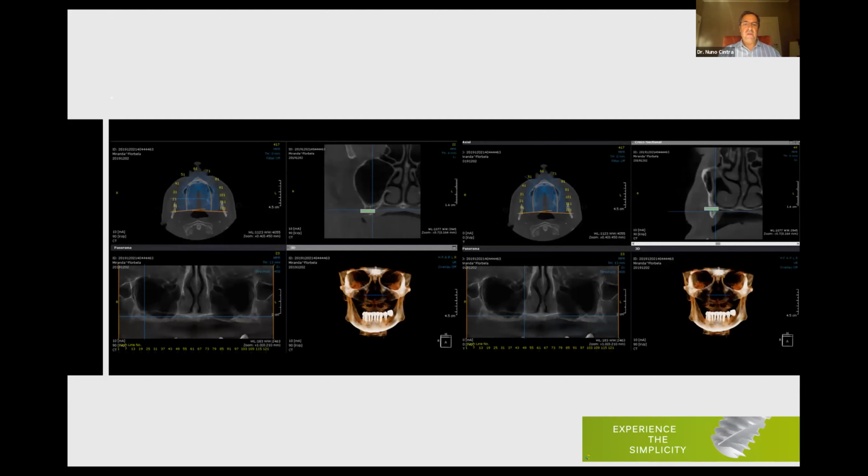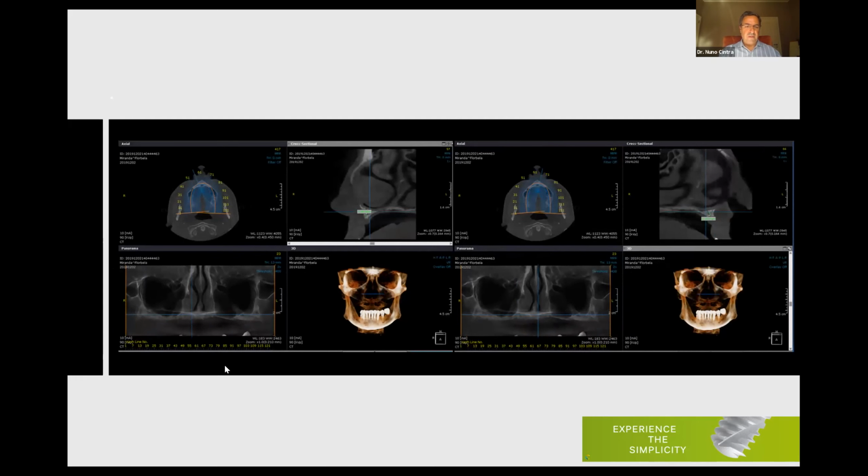because we have to think that sometimes we have some discrepancies in the CT scan readings. So situations like this one, look at this case. If you see the measures on my left side there, I had 6 millimeters height. Then at the front, I had 7 millimeters, as you can see. In the middle, I have around 5 or 6 millimeters on both sides.